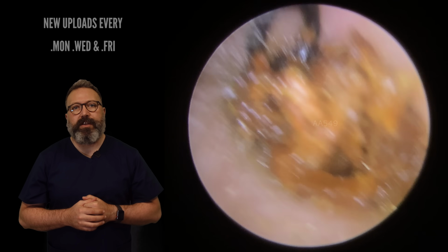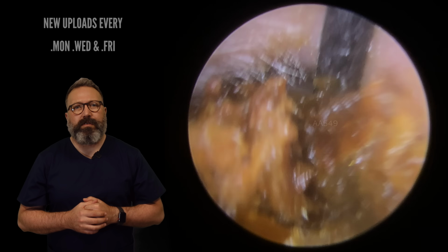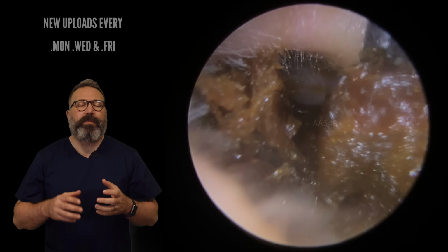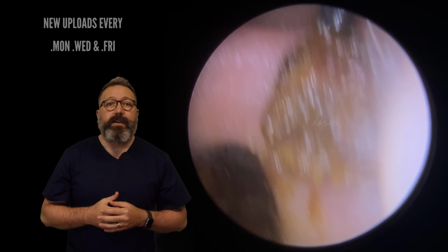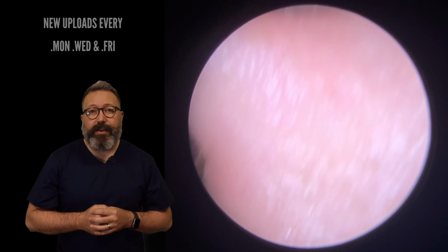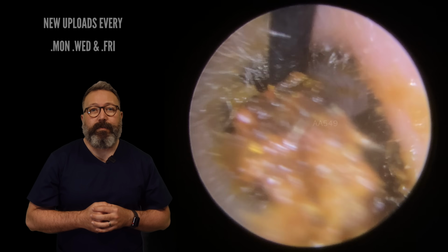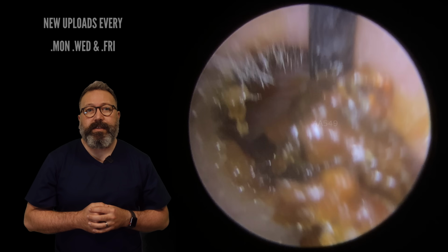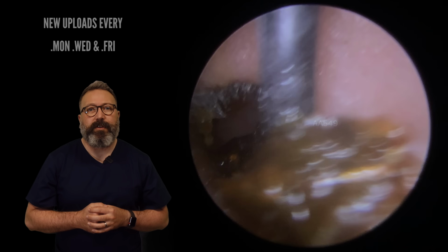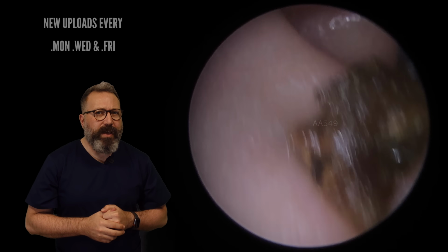Now, there we go. It's actually brought the next section forwards. So we'll go back in now, grab, oh, it's not, I thought it was going to pull the whole plug, but it's just taking one side of it away. So that's fine. We'll get rid of that bit first, and we'll go back in then, get the next section. Here we go. There we are. And it started to draw another piece forwards by the looks of it. I can just see the remainder left of the entrance to the ear canal there, but some big old chunky pieces.